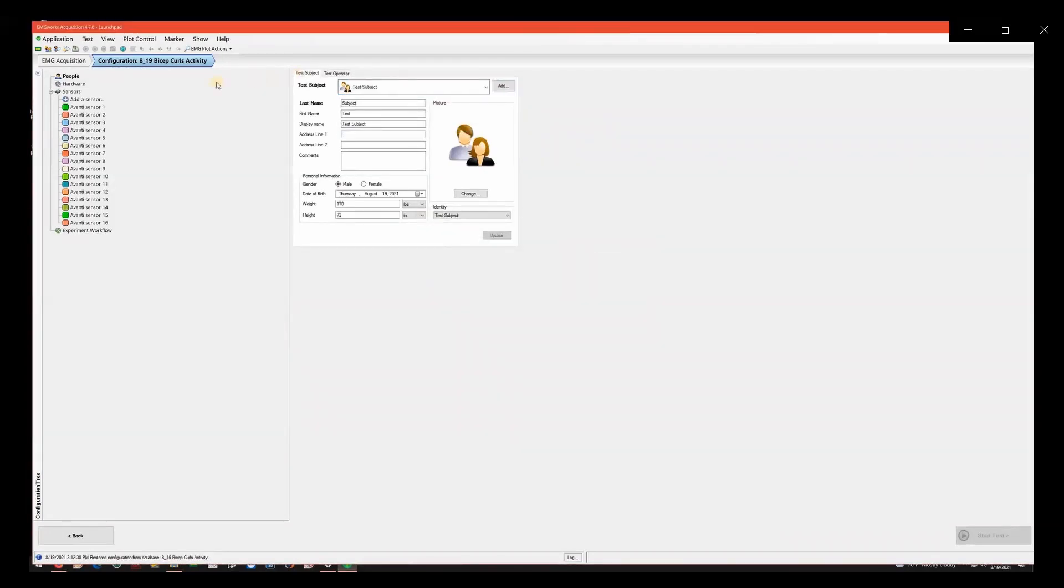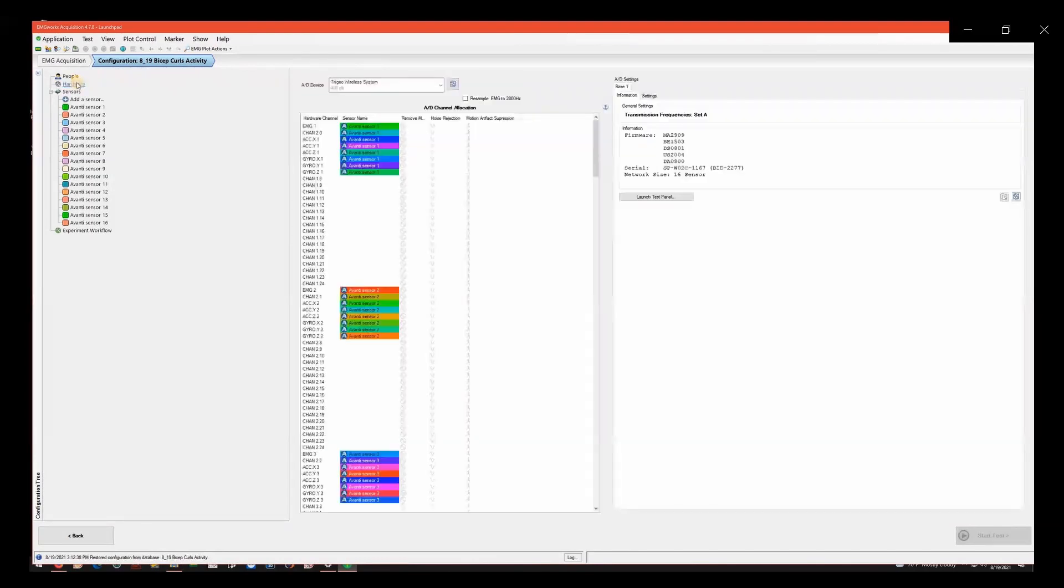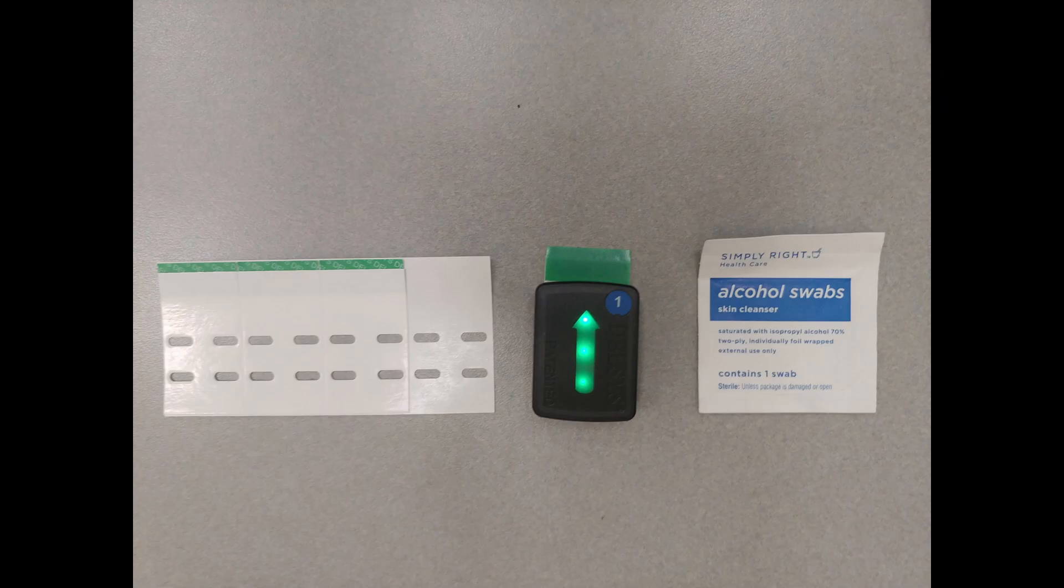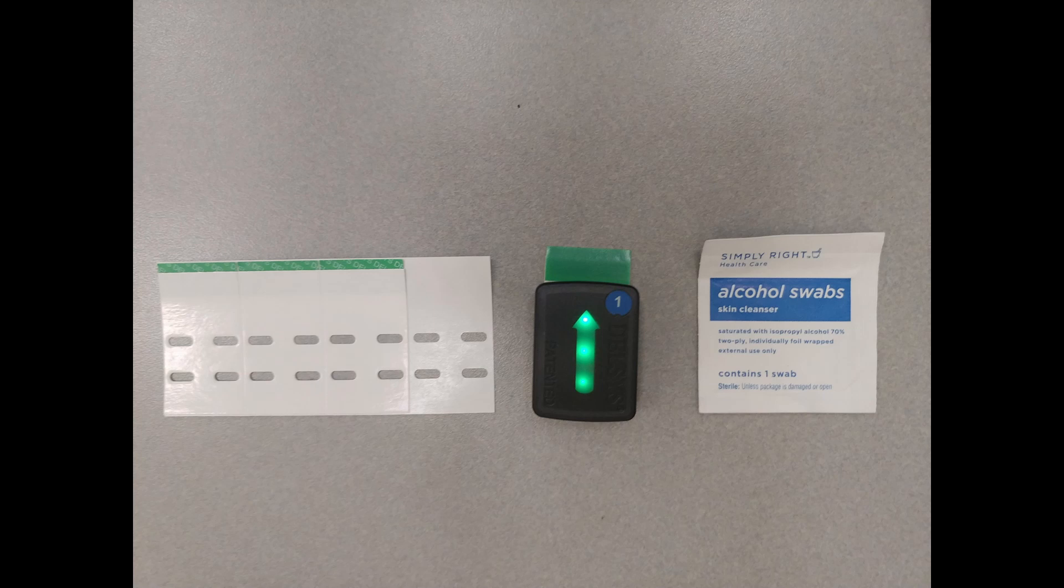Next, click on Hardware. Visually verify that the Trigno wireless system is selected as the A-D device. You should also check the physical Trigno base unit to make sure everything is connected properly. The EMG lights should be on. They will display a solid green light when fully charged.